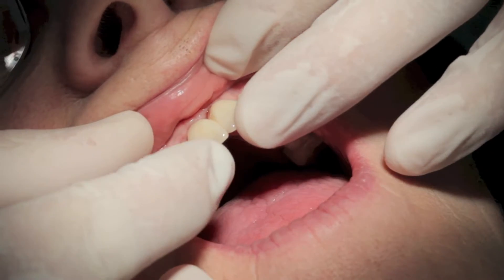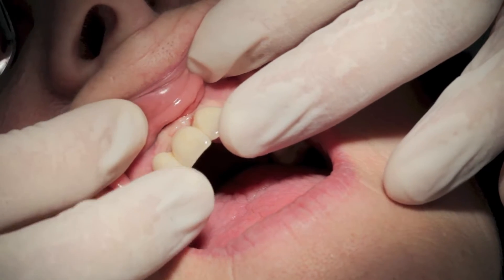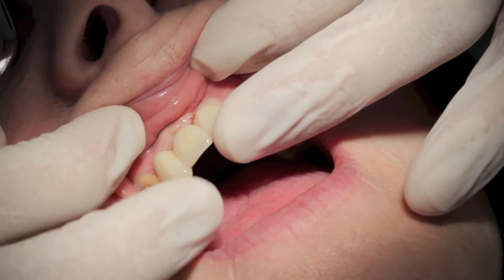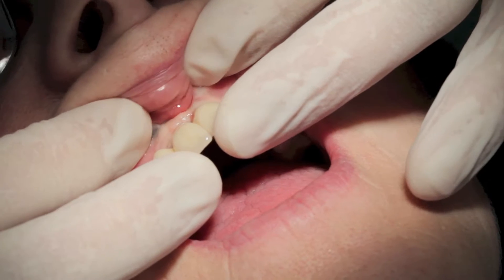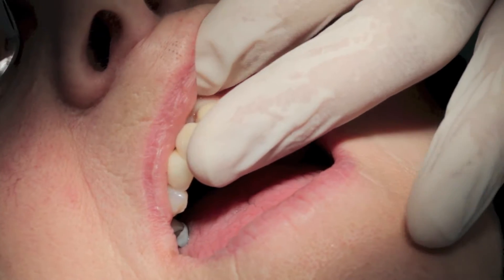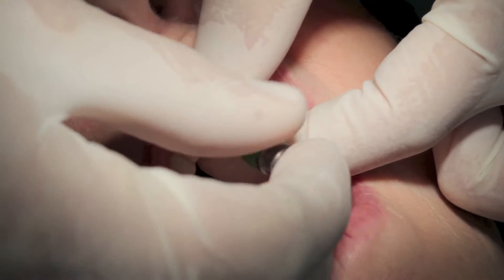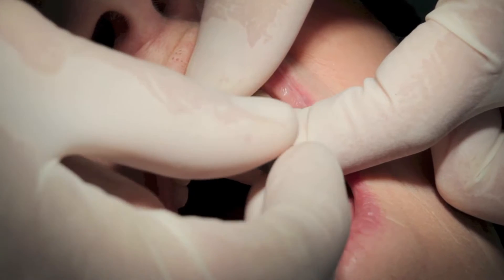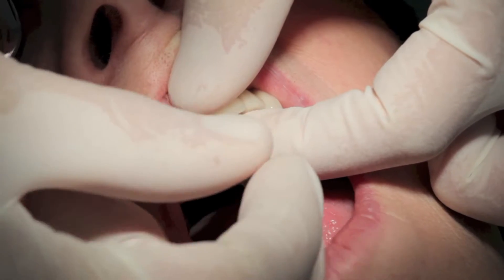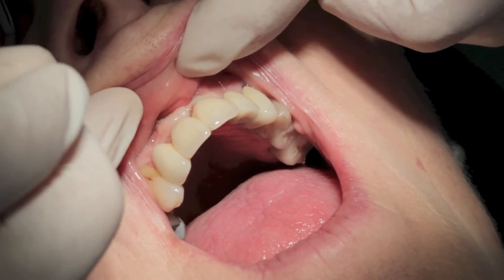So the implant bridge is gently pushed onto the implants. You can see there's a little bit of blanching of the tissues — hopefully not too much, because we've relayed the information from the sulcus formers which give the technician all the information he needs to develop a really good emergence profile of the teeth. There is usually a little bit of pinching of the gum but not normally sufficient to merit local anaesthetic. However, on occasions it is necessary if it clearly is uncomfortable. You just need to warn patients there will be a feeling of tightness and some pinching potentially, and just to stop and wait for things to settle if that is the case.